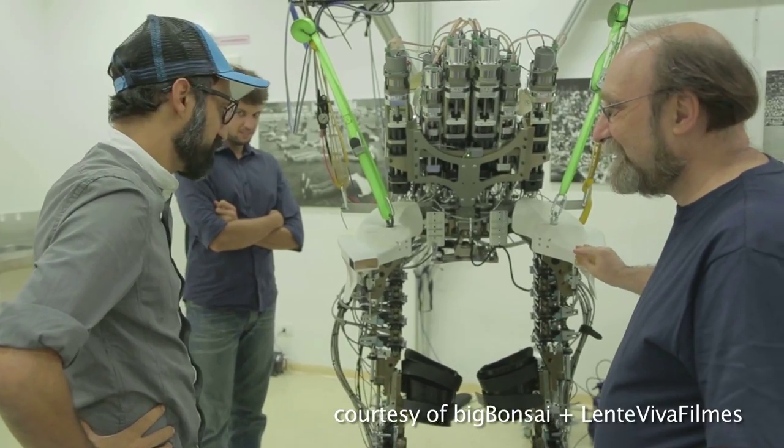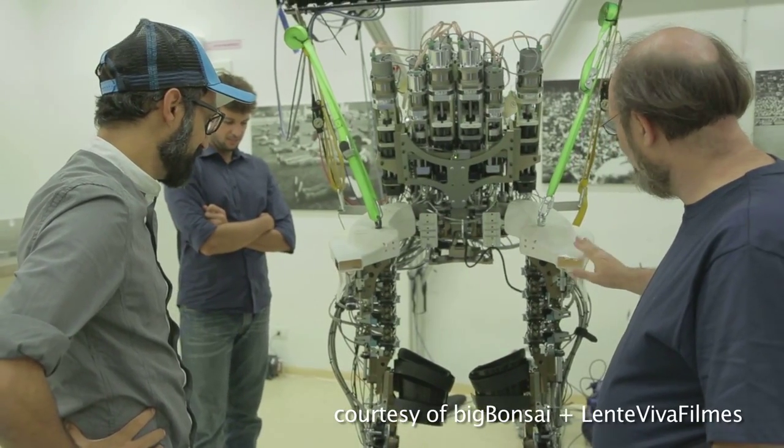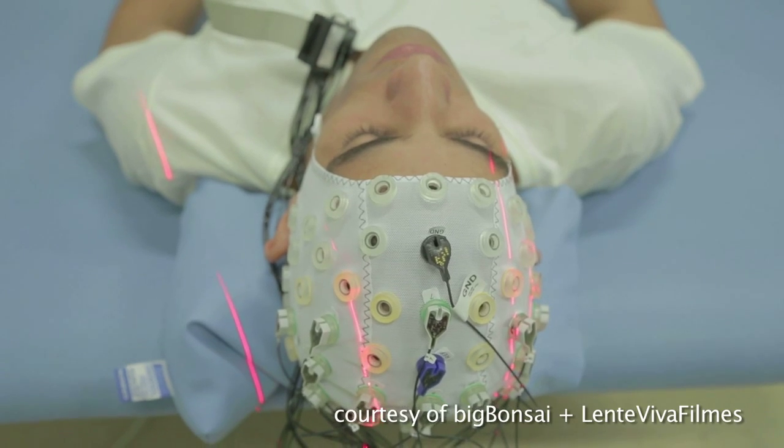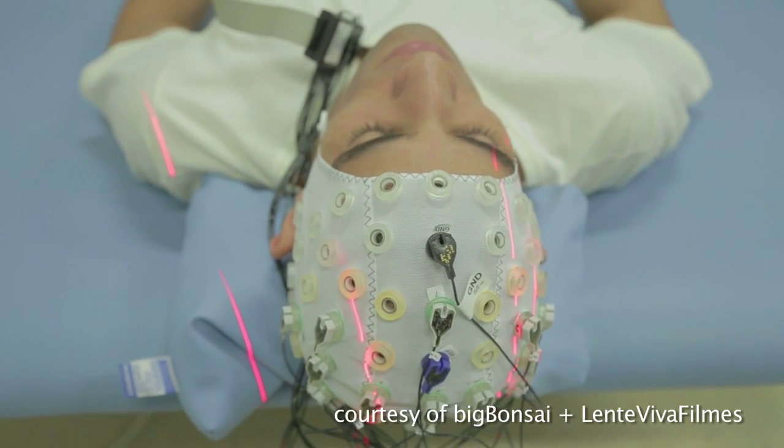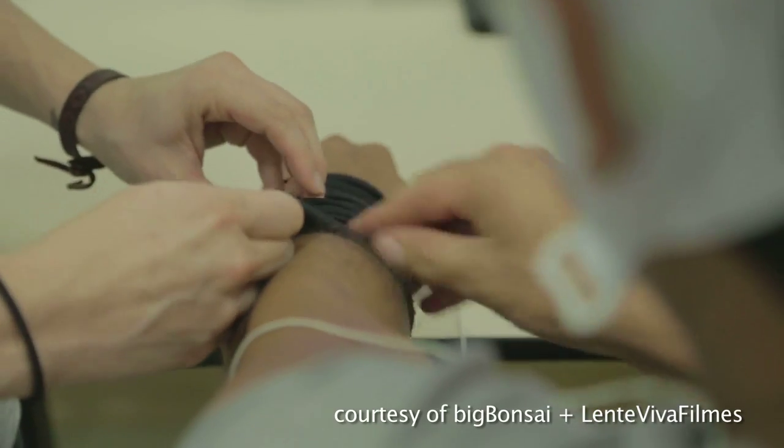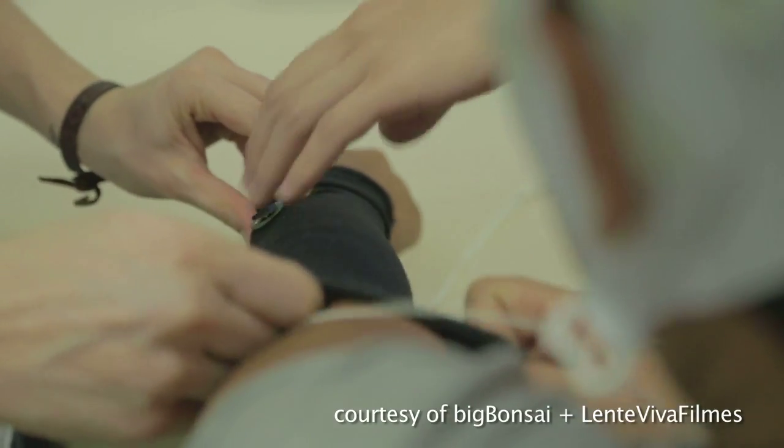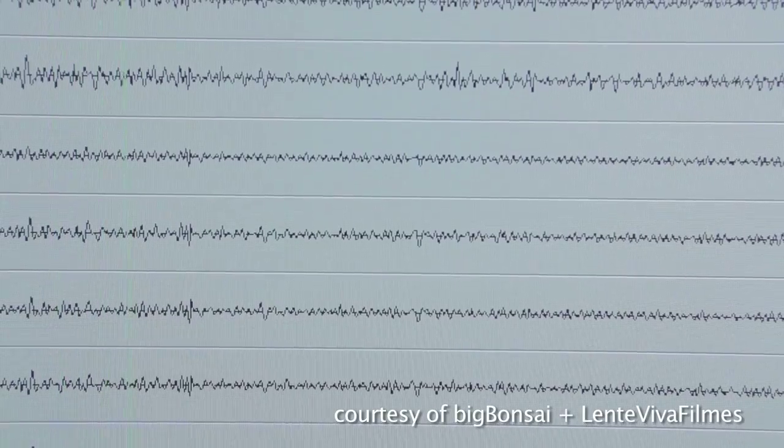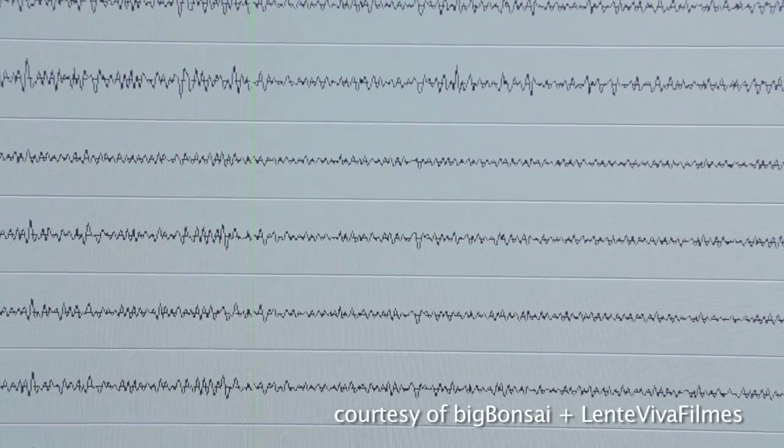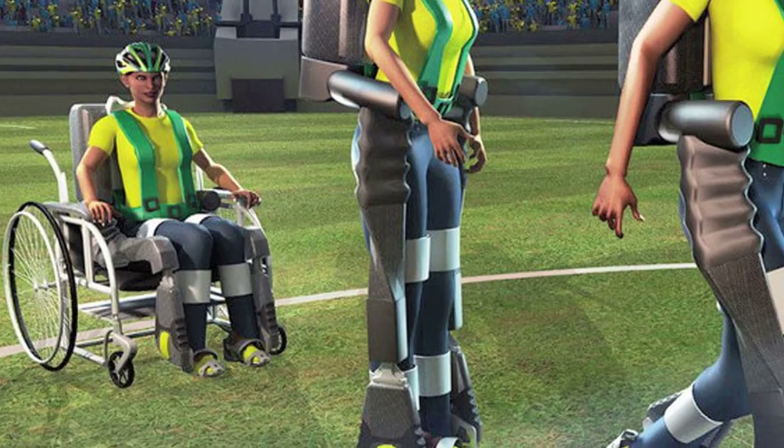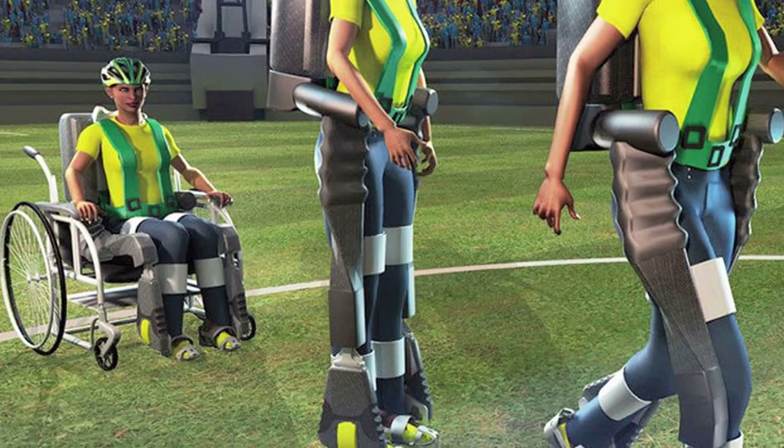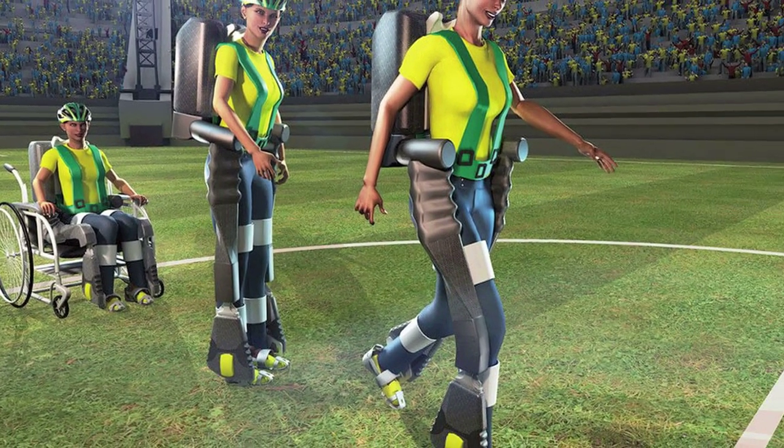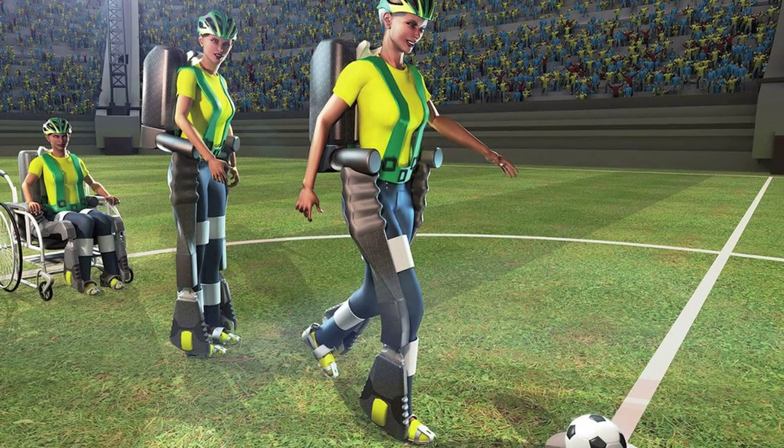The World Cup's exoskeleton will use an EEG cap rather than implanted electrodes to read brain activity. The patterns will be interpreted by computer algorithms and the exoskeleton's hydraulic pumps will power it forward.